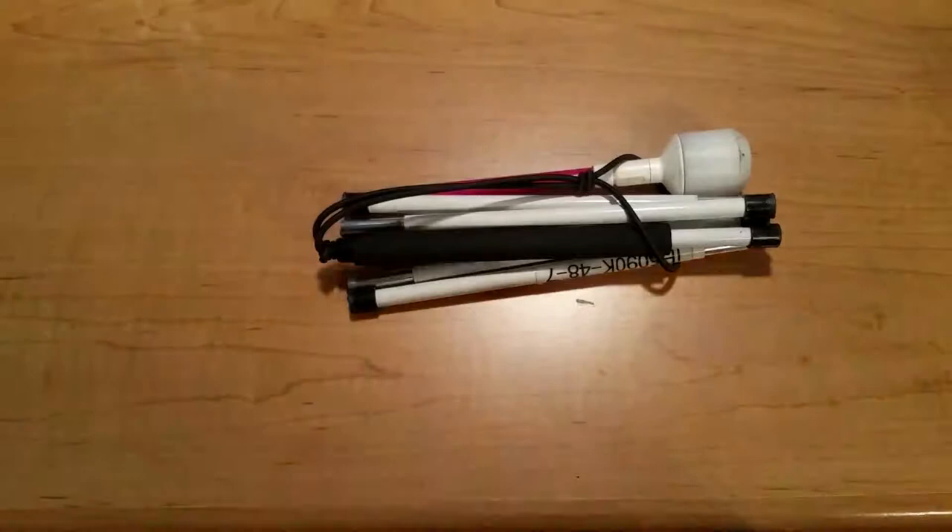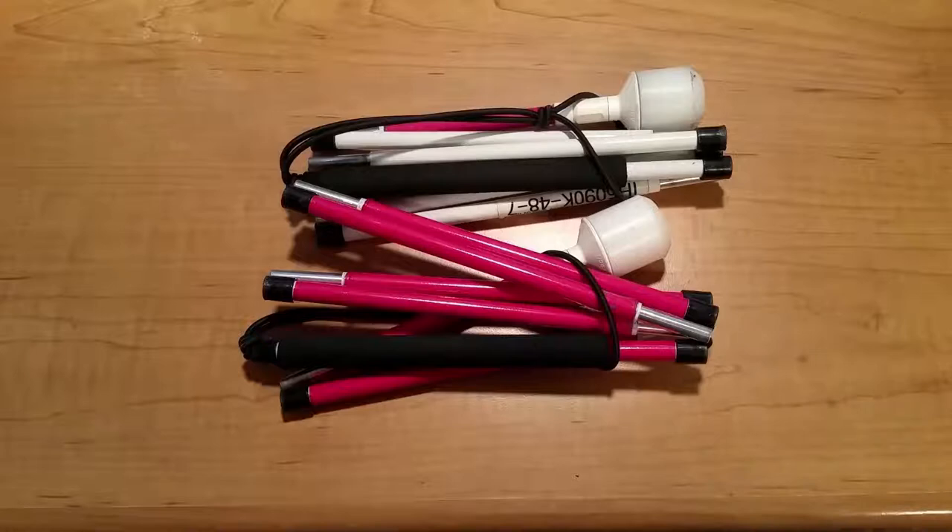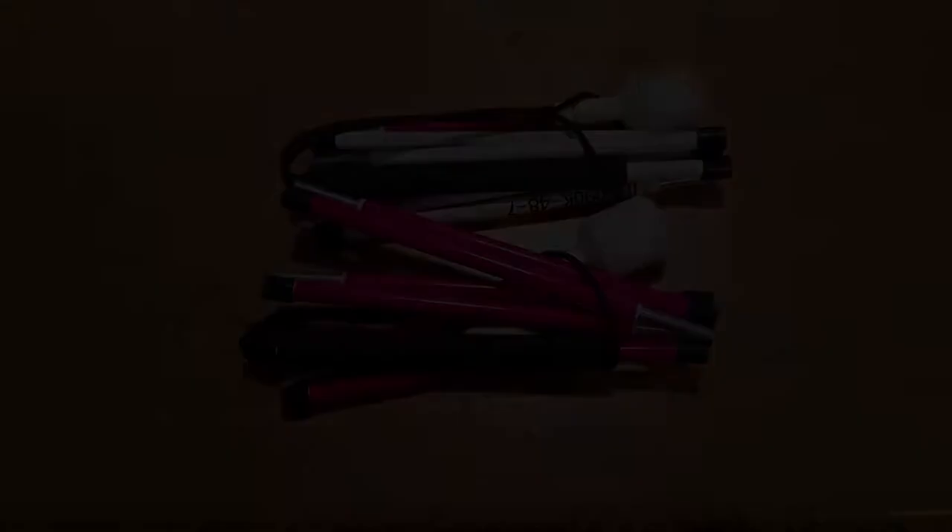Number one pro is obviously the size. These are ultra portable. You can easily fit them in your purse, and they are so small that if you have fairly big pockets on your jacket you can even shove these in without worrying they're going to fall out. With some of my jackets the pockets are so big I can completely insert this, zip up the pocket, and it stays secure without any worries.